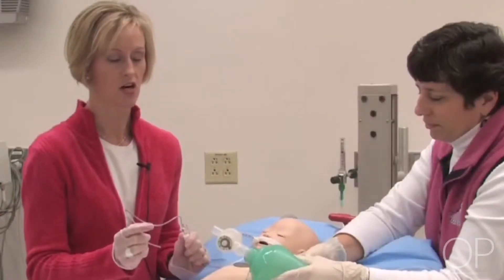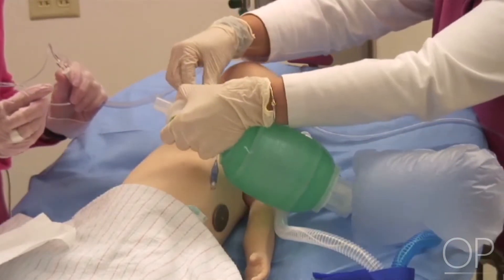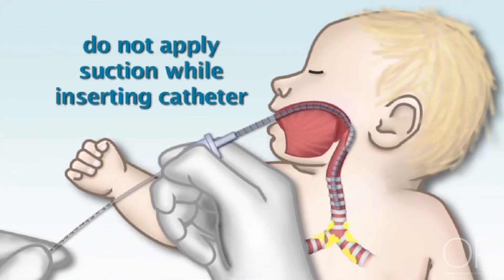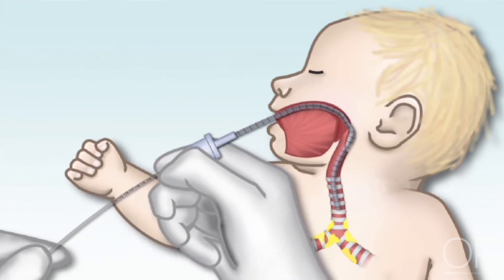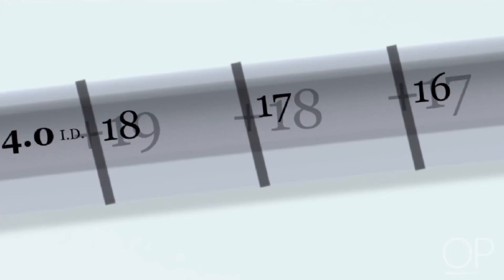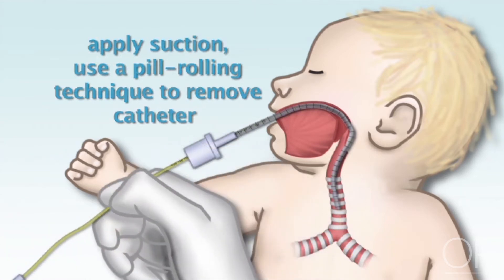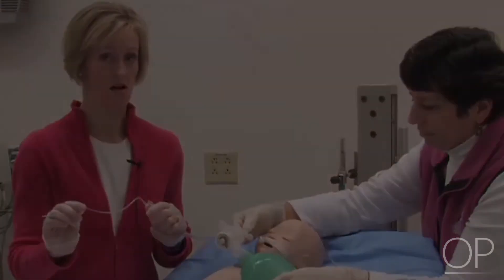I'll ask my colleague to disconnect. I'll note the markings on my tube and start to pass, not applying any suction while I'm passing the tube. I will line up the numbers and go past, start to apply suction, and using a pill rolling technique, remove the tube. I do not want to apply suction for any more than 10 seconds at a time.